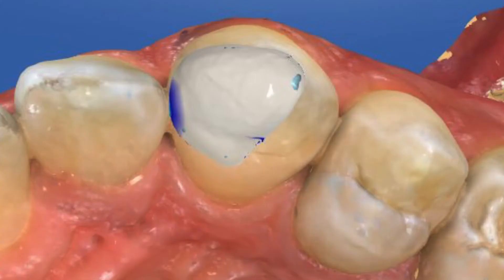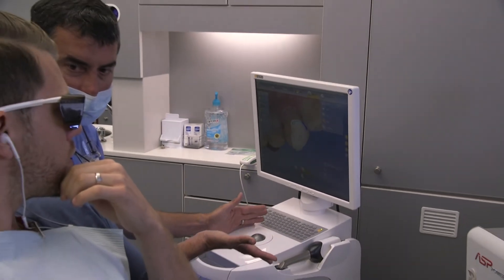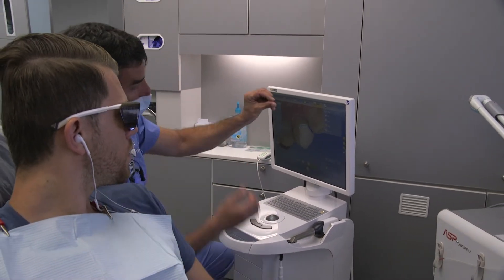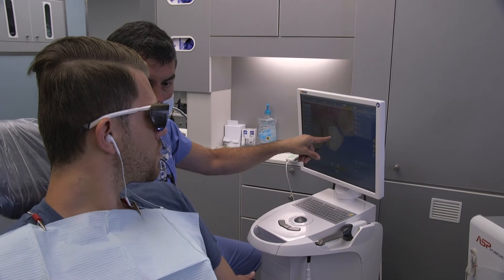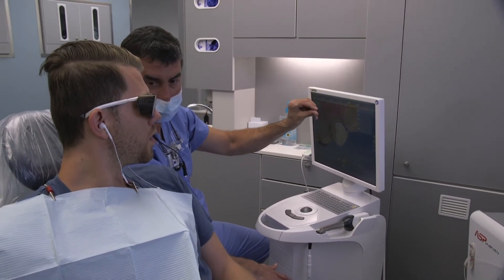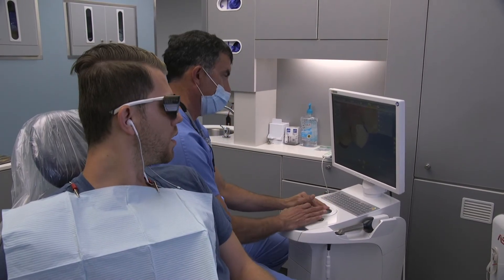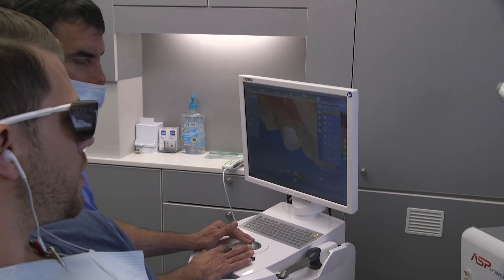It'll be stronger and it'll replicate exactly. Yellow-white means it's within about 40 microns — which is four hundredths of a millimeter — of where it was. A millimeter has a thousand microns, so 40 microns is really small. And the chances of me busting this are way lower than what I had before — that's exactly why we're doing it.